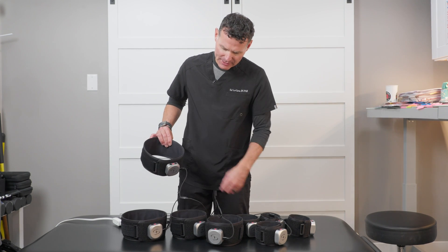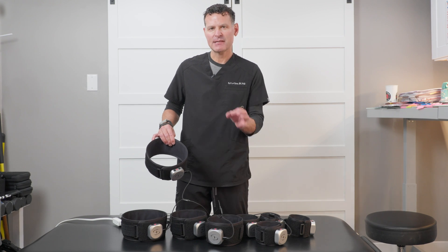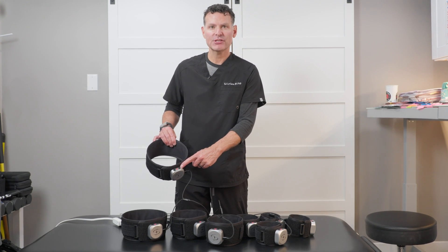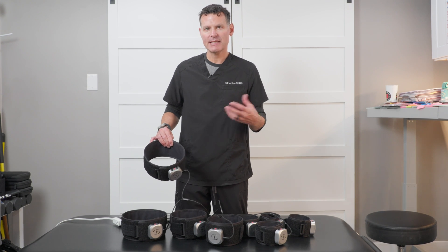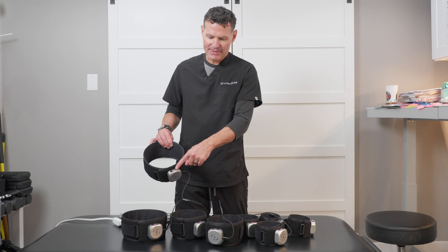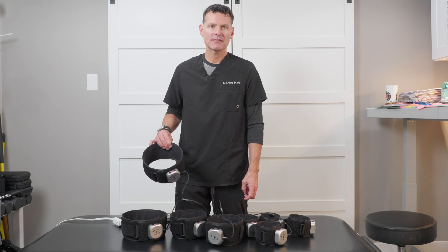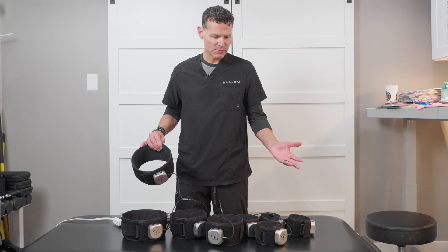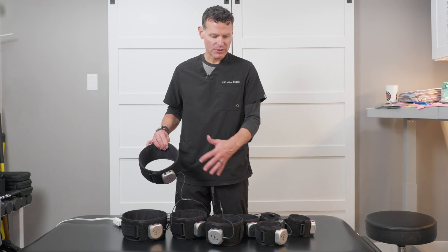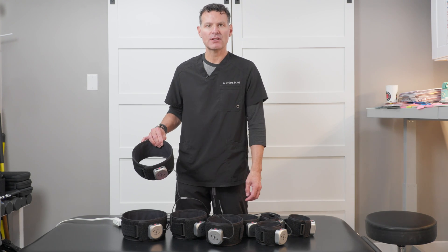There are two other buttons I should point out. Number one is your power button, which has the typical power symbol. The other is for emergency release — if you need to release all the pressure in the cuff, just hit that button and all the pressure will immediately deflate. Charge these up until you get a green light on each cuff before doing anything else.